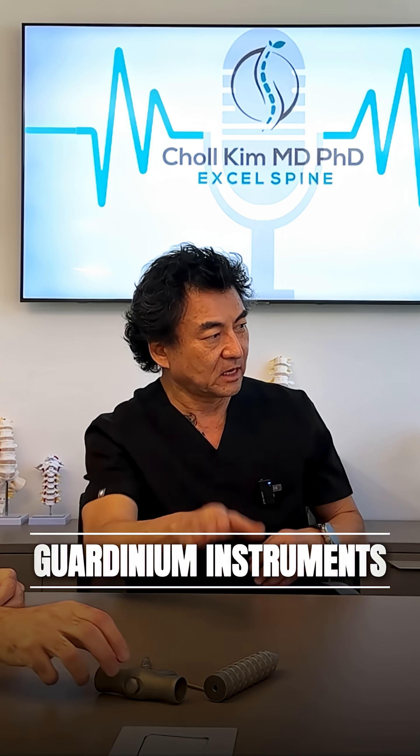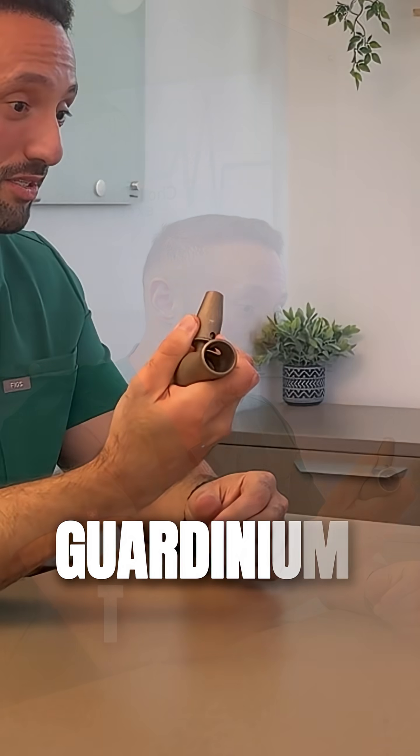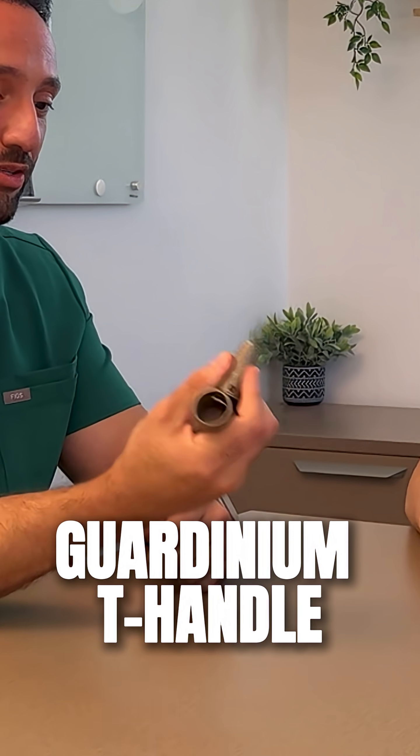These are the actual Guardinium metal instruments that exist today — there are three of them right there, which is really nice because handles are going to be one thing we make a lot of contact with, especially interchangeable ones like this. This is a great idea because it feels like regular titanium, and something like this passes back and forth from the scrub to the surgeon multiple times, and each time there's a handoff there's a chance of contamination.